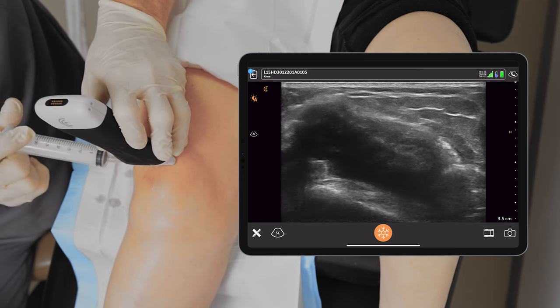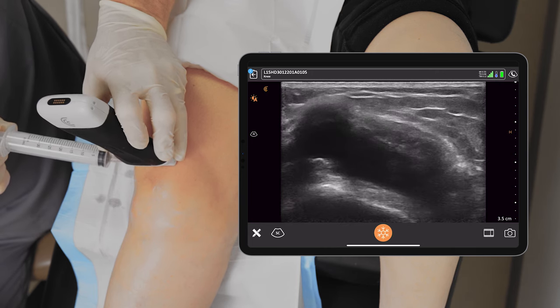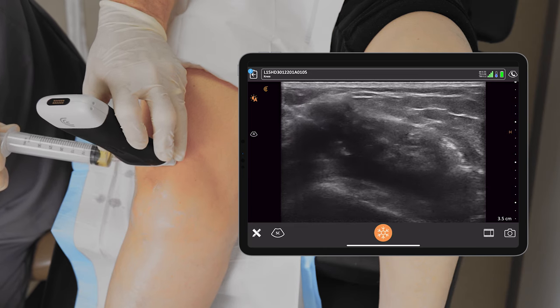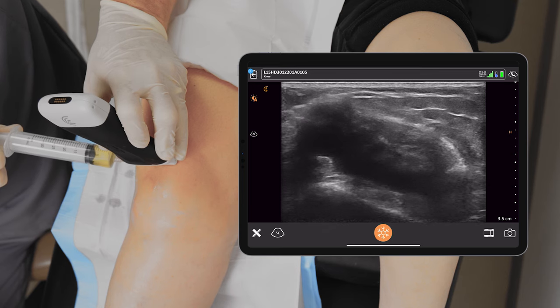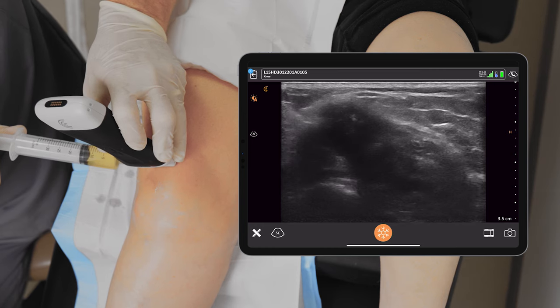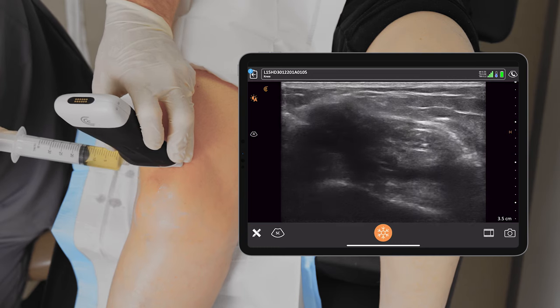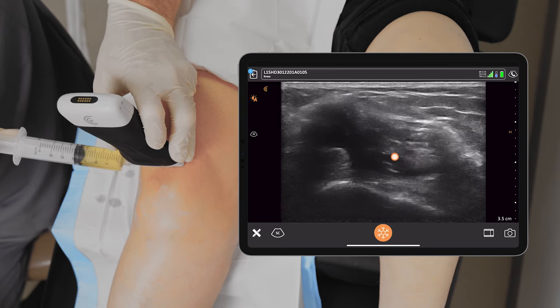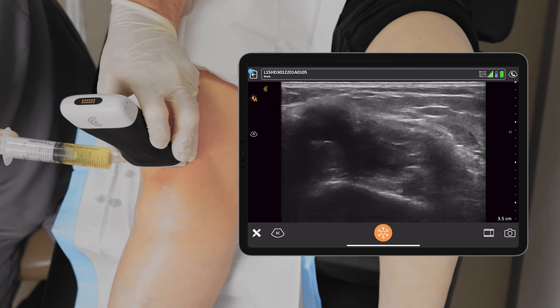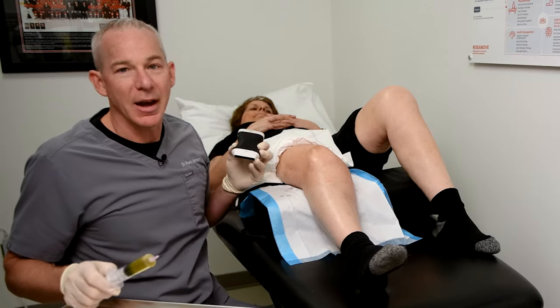Here's where using ultrasound guidance is paramount. If I were doing this without ultrasound guidance, if my needle tip were to travel superficially, I'd land in the quadriceps tendon and wonder why I wasn't getting any effusion. If my needle tip were to travel deep, it would land in the pre-femoral fat pad and I would wonder why I wasn't getting any more fluid. There we can see the needle tip between the two. So that is essentially how I do an ultrasound guided aspiration of a knee effusion, and we're ready to inject the PRP now.